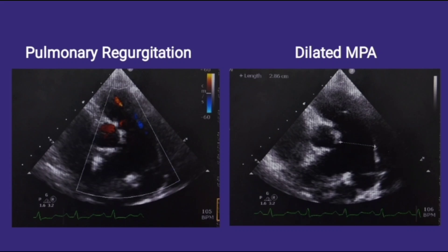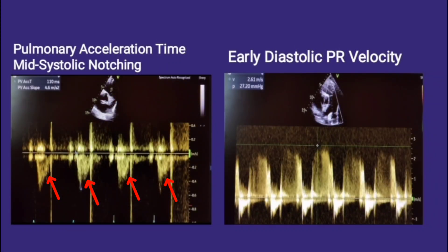In the first echo image, you can appreciate a red colored PR jet in the short axis view at the aortic level. The second image shows a dilated MPA. In the third image, we can see pulmonary acceleration time and mid systolic notching — both can be measured by putting pulse wave Doppler at the pulmonary valve in short axis view. A PAT less than 100 milliseconds and the presence of systolic notching implies pulmonary hypertension. The last image shows the early diastolic PR velocity, measured by putting continuous wave Doppler at the pulmonary valve level.